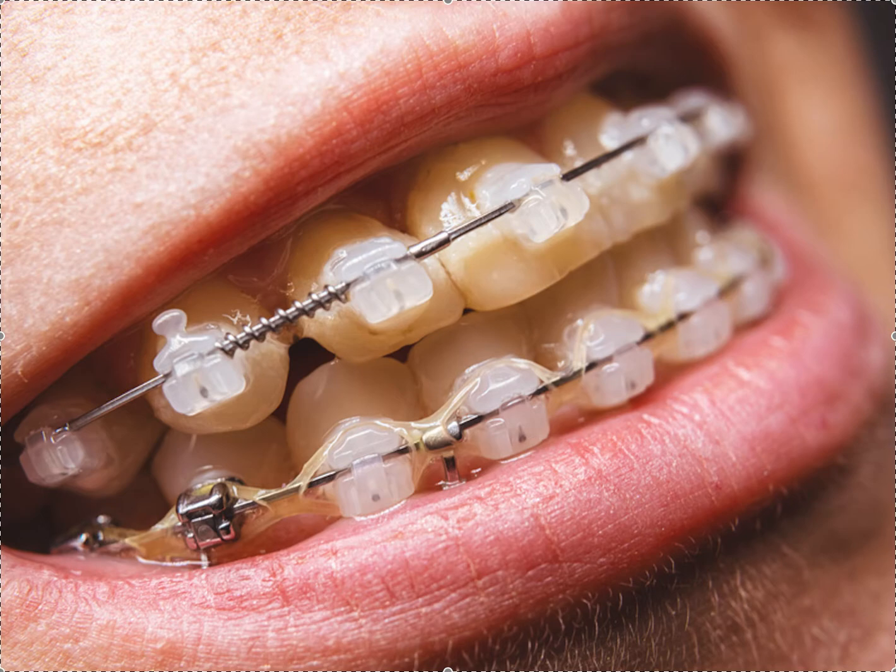Hey, it's Dr. Amanda with Straight Smile Solutions, straightsmilesolutions.com. Today I want to talk about the benefits of self-ligating brackets. There's a lot going on in this picture, and this is why I like this picture. You may not even know what a lot of these components are, but these are definitely self-ligating brackets.